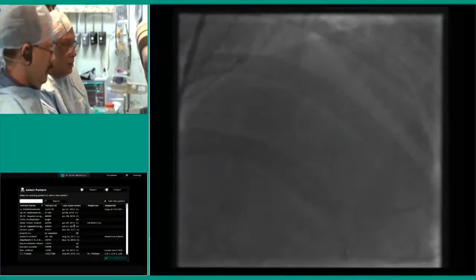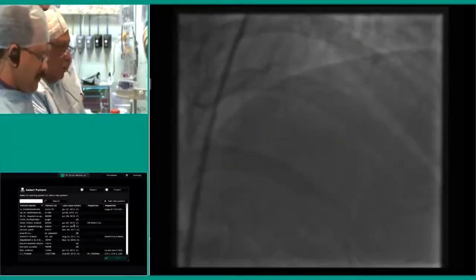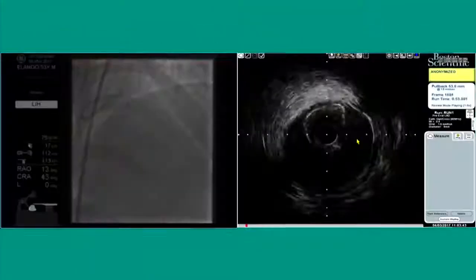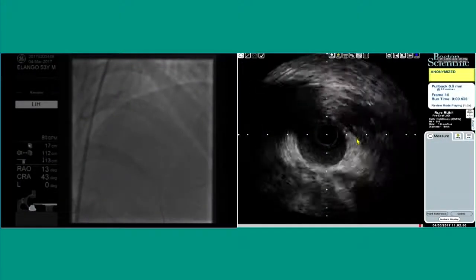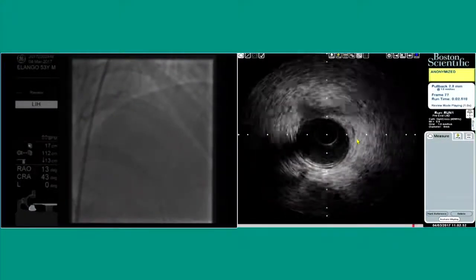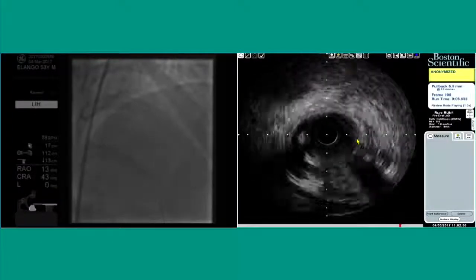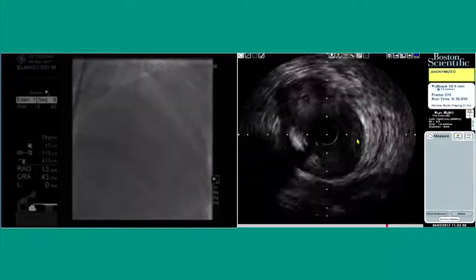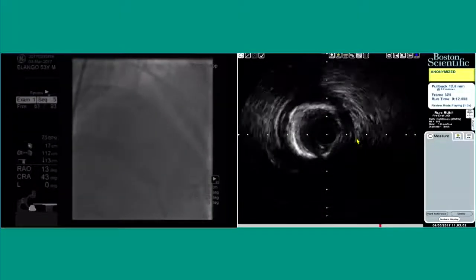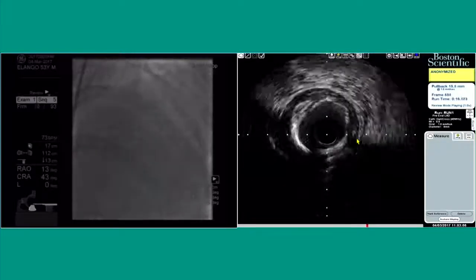No, not necessarily. Do we need a rotational atherectomy or not? I want your comment. See, looking at the IVUS once again. Show the picture again, IVUS. I saw the image. Anything which has got a circumferential calcification, in one part, yes, I would rotoblade. And this is pretty much 270, yeah, this is close to 360 degrees.